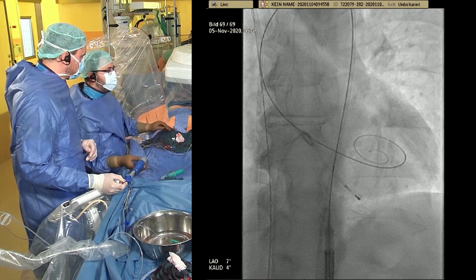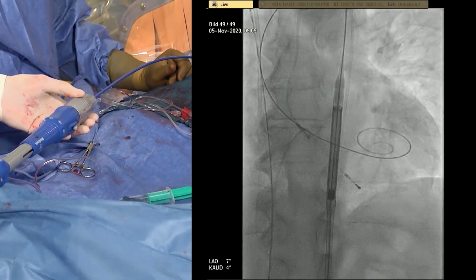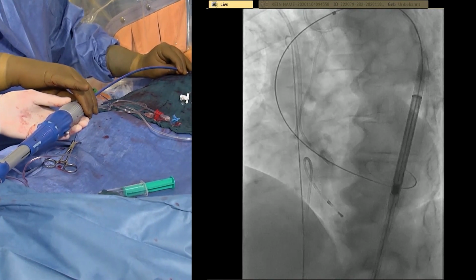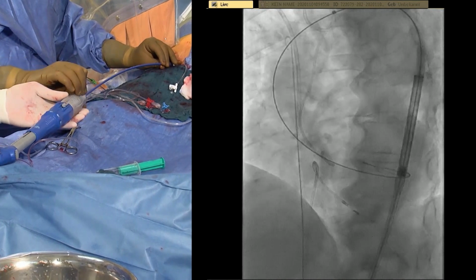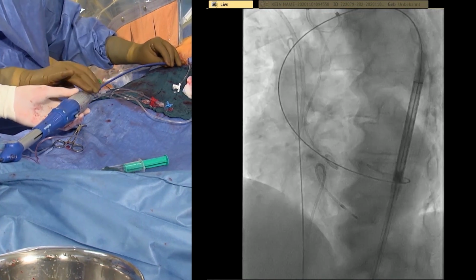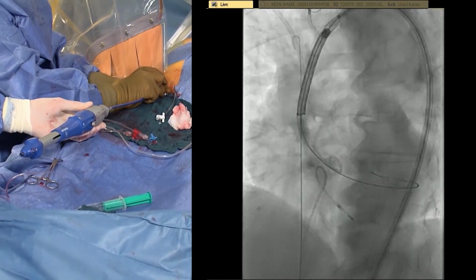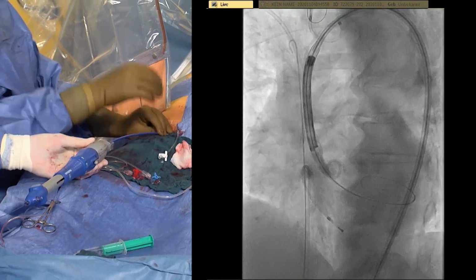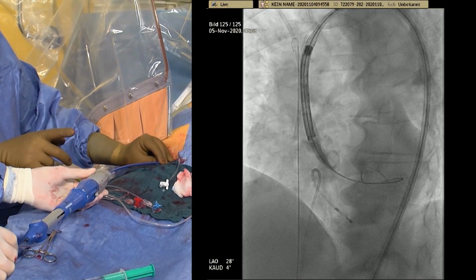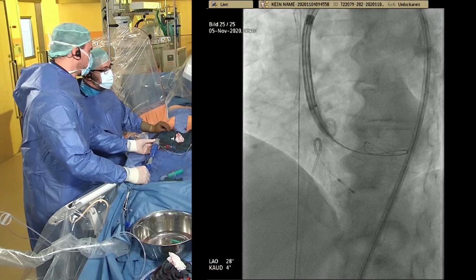If you go at 3 o'clock, then probably, as you can see here on fluoroscopy, in a normal anatomy, you will see here that the hat marker, if we go a little bit in LAO, open up the curve a little bit, the hat marker will be probably at the outer curve. You cannot see it here quite nicely, but you will see it when we cross the arch. So in this case, the hat marker is, as you can see here now, when we go at 12 o'clock, it's on the outer curve. We'll remain, actually, despite this fact here, in this case at 3 o'clock, cross the arch and see now where we will land. So we can see here that we are coming actually very nicely through the outer curve. So despite that the hat marker was not on the outer curve in the descending aorta, just by maintaining the 3 o'clock position, you usually obtain a very nice position in the ascending aorta, and this is actually what matters.